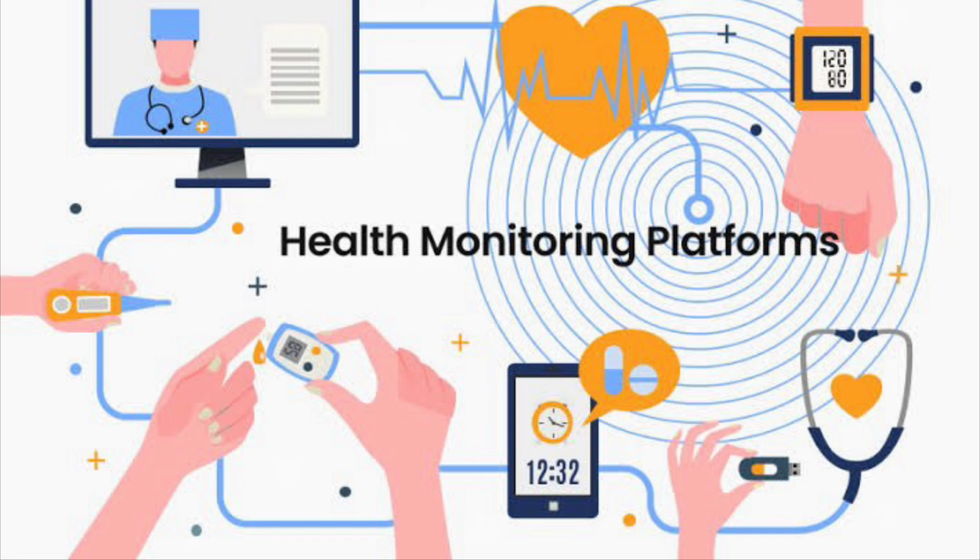So one has to essentially understand the core nature of vital signs monitoring. First, whether it is continuous vital signs monitoring for patients admitted in a hospital, which might be beneficial in a very select subset of patients, like those in intensive care, or immediately post-op, who need continuous monitoring.